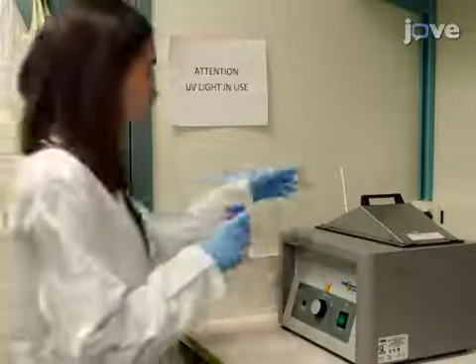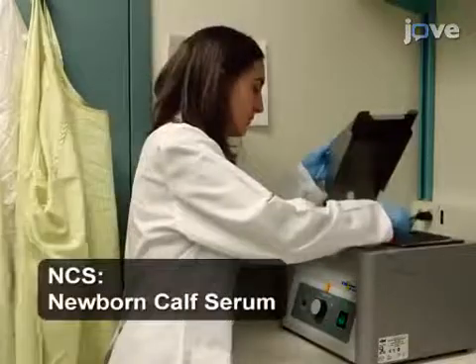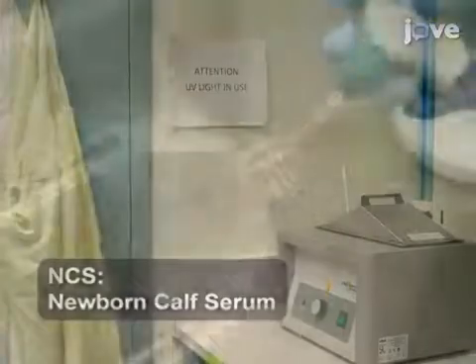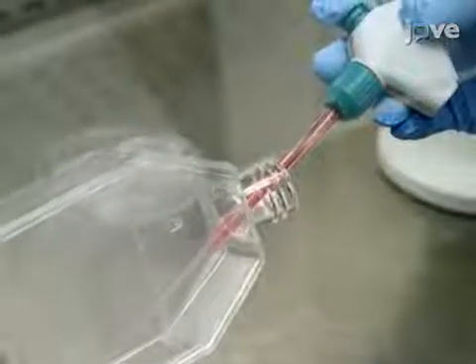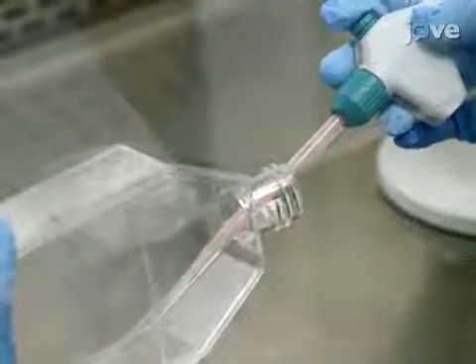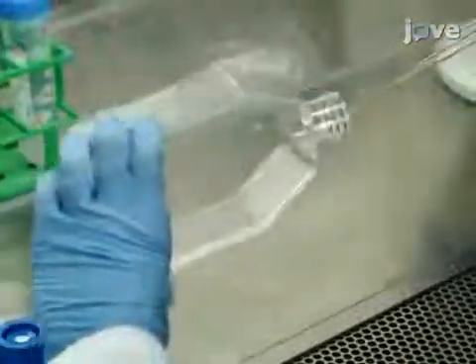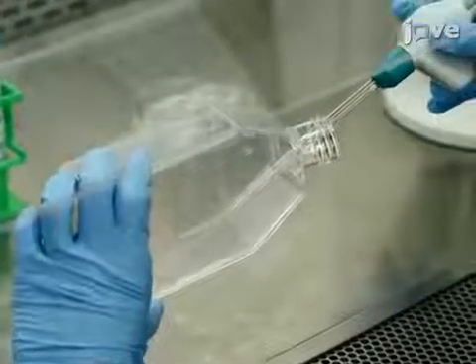In the meantime, warm DMEM with 10% NCS to 37 degrees Celsius in a water bath. Afterward, remove the DMEM from the culture flask using a glass pipette. Subsequently, wash the flask bottom with warm sterile PBS to remove the remaining DMEM residue.